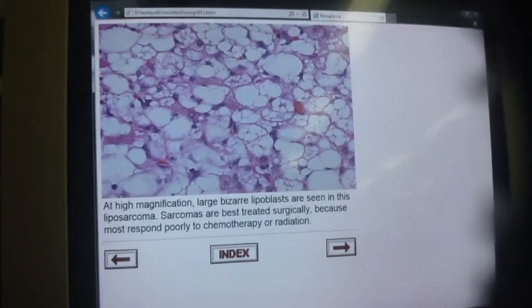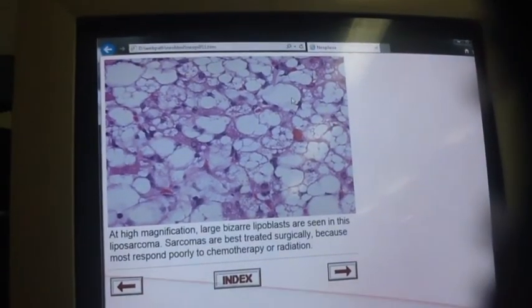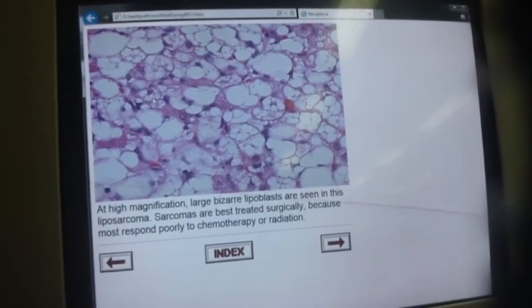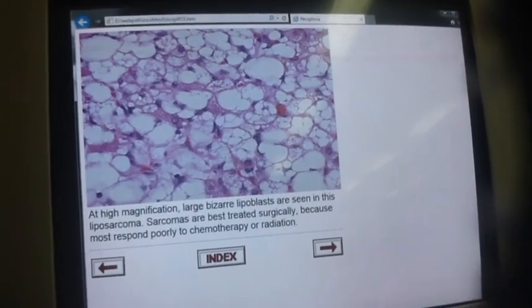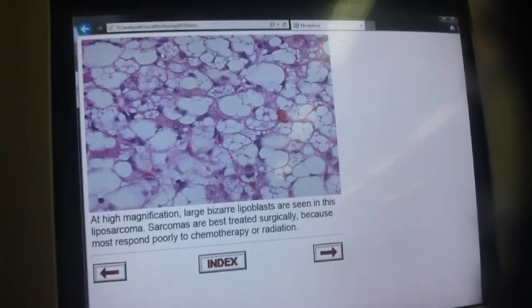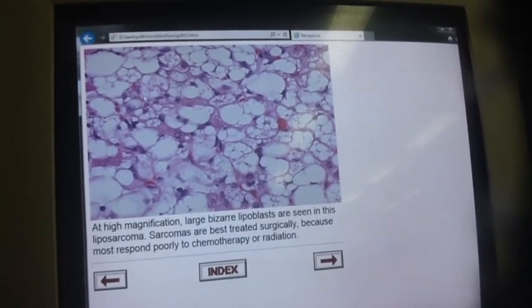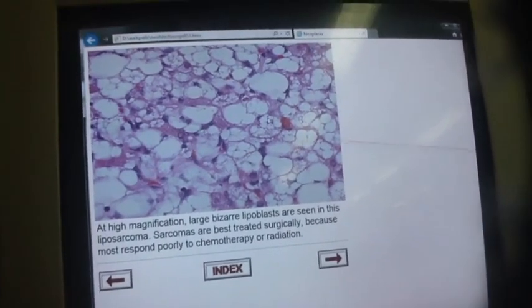This is a higher magnification. The larger cells, as we said, are the benign ones, which are called adipocytes, while the smaller ones, which are composed of vacuolated cytoplasm and very folded cytoplasm, all these smaller cells with vacuolated cytoplasm are lipoblasts, which are the malignant cells, while the larger cells are the benign ones, which are called adipocytes.